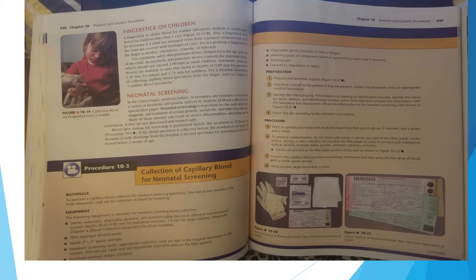Perform the capillary skin puncture as previously mentioned and wipe away the first drop of blood with a sterile gauze sponge. Allow another large blood drop to form.